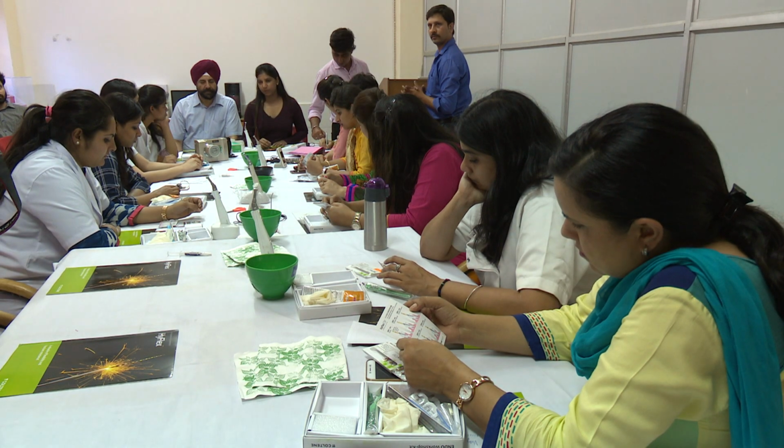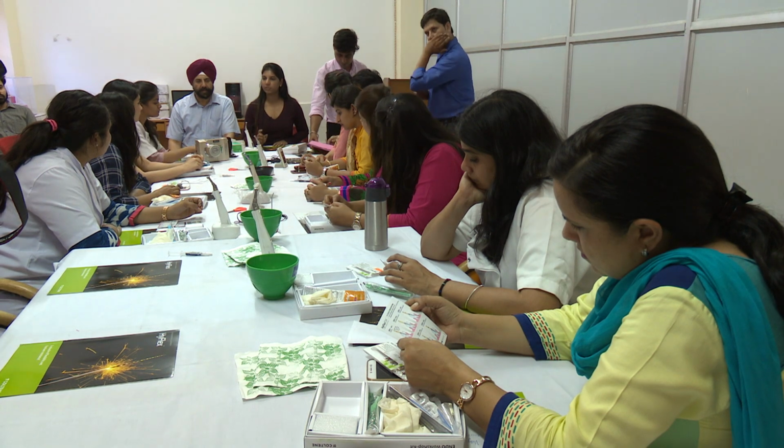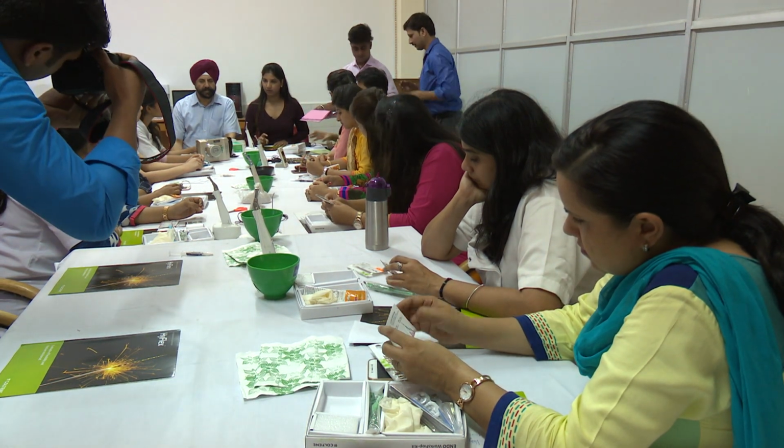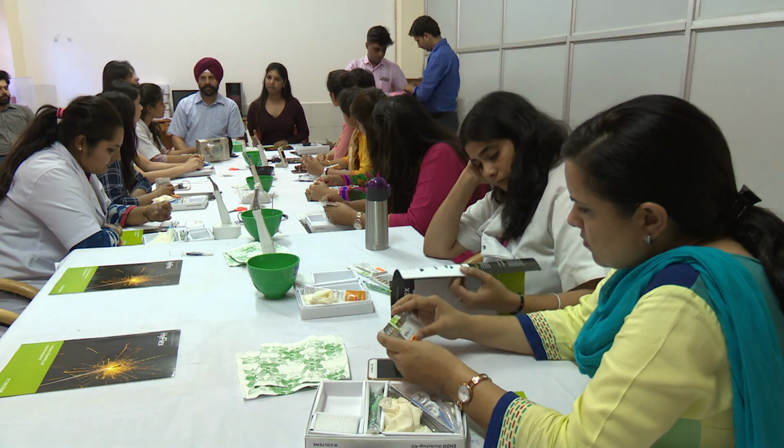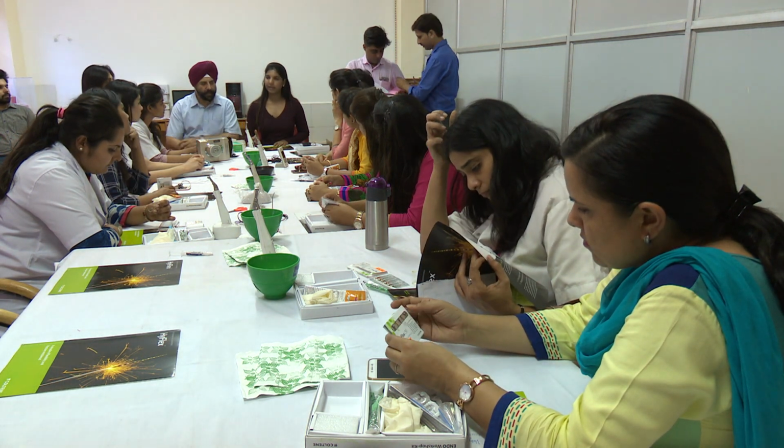Now, what is the purpose of the orifice shaper? The orifice shaper is supposed to shape the coronal part of the canal, so that there are no hindrances in the coronal part. Once you remove the hindrances from the coronal part and make it straight, it is very easy to execute.